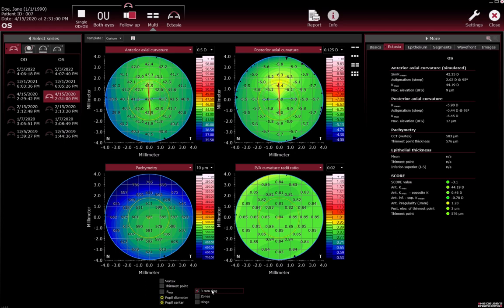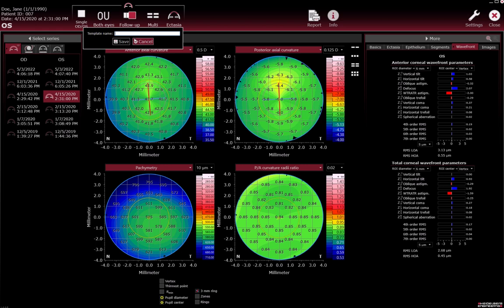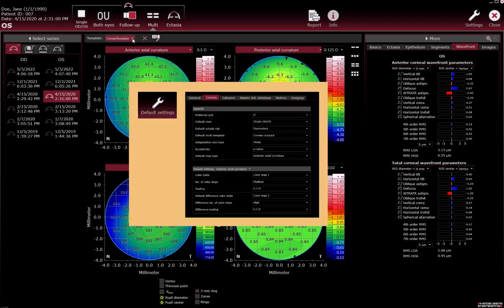Select the checkbox of the desired overlay for this template and select the desired tab in the More section. To save the changes, click the disk symbol and enter the desired name of the template, then click Save. On all workstations in the network, the new template can now be selected from the template drop-down list. It is possible to select a default layout to appear automatically when opening the Cornea app — save the desired view and template as default.